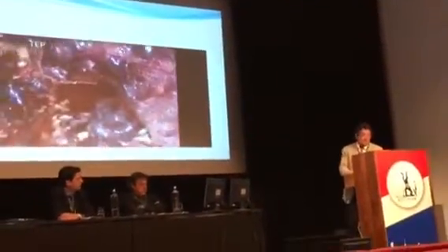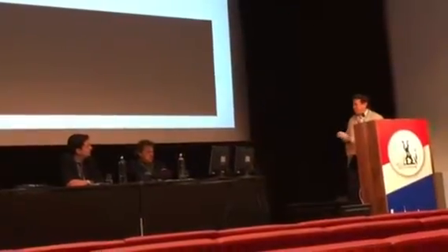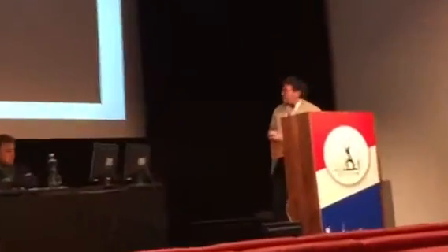You don't need to tap, you don't need to convert to open surgery, you just have to come to a laparoscopic approach through the same wound. So, thanks for your attention.